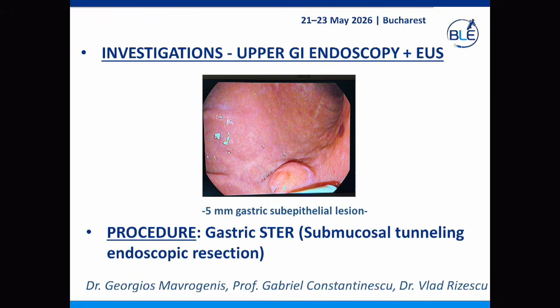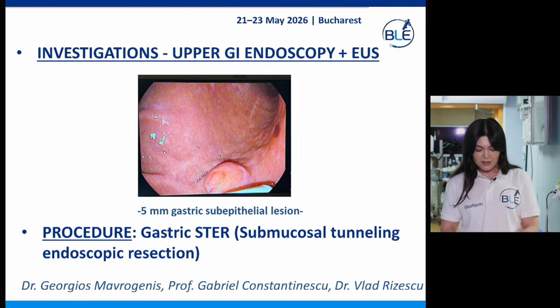The procedure that will be done today for her is a gastric STER, a submucosal tunneling endoscopic resection, by Dr. Georgios Mavrogenis, Professor Dr. Constantinescu, and also Dr. Vlad Rizescu.